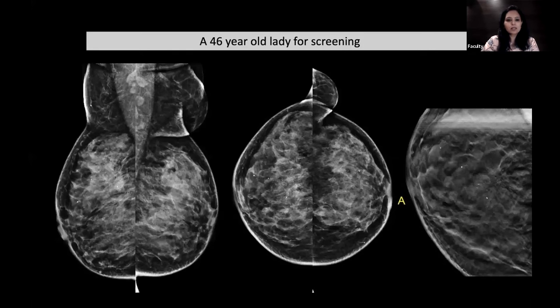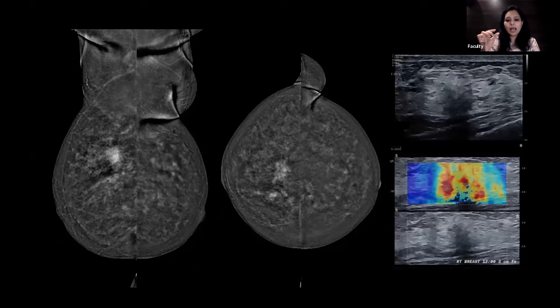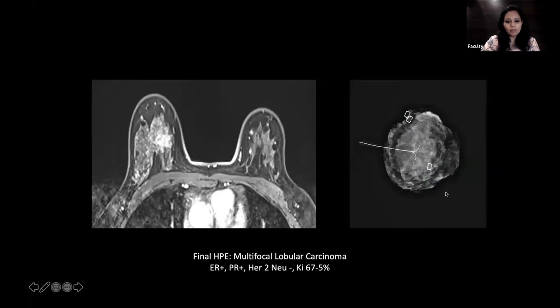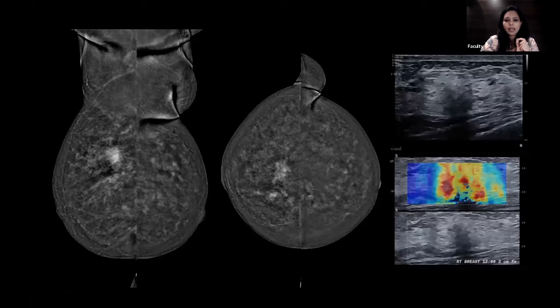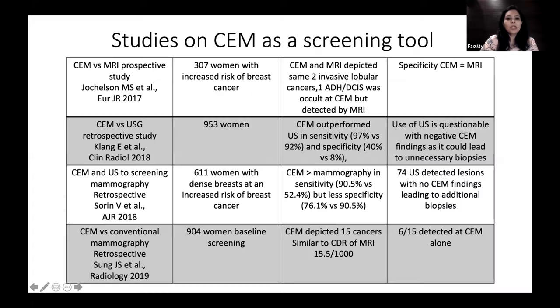A 46-year-old with very dense breasts presented for screening. An area of isolated architectural distortion was noted on the right breast; contrast showed an enhancing abnormality corresponding to it, plus additional enhancement adjacent to it. Compared to the plain mammogram, the area was much larger on contrast enhanced mammography. Ultrasound showed a hard peripheral stiff rim on elastography. Biopsy confirmed multifocal lobular carcinoma, demonstrating that contrast helped identify a wider area of enhancement and additional foci.